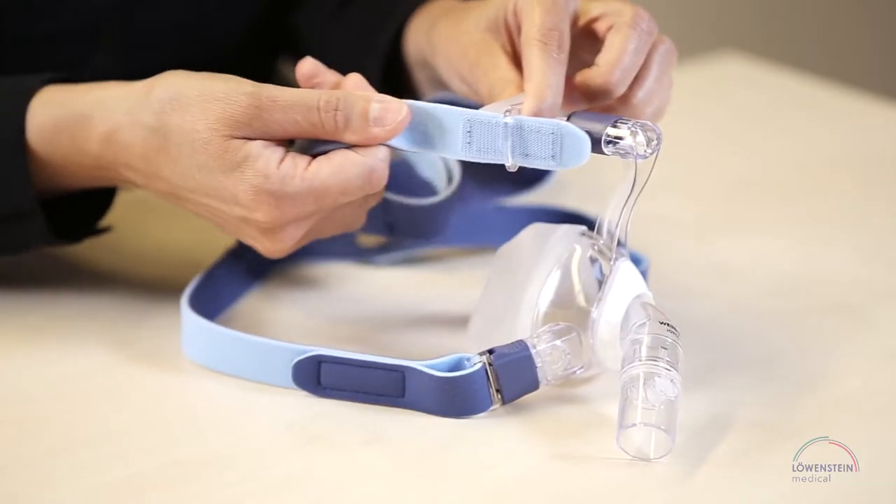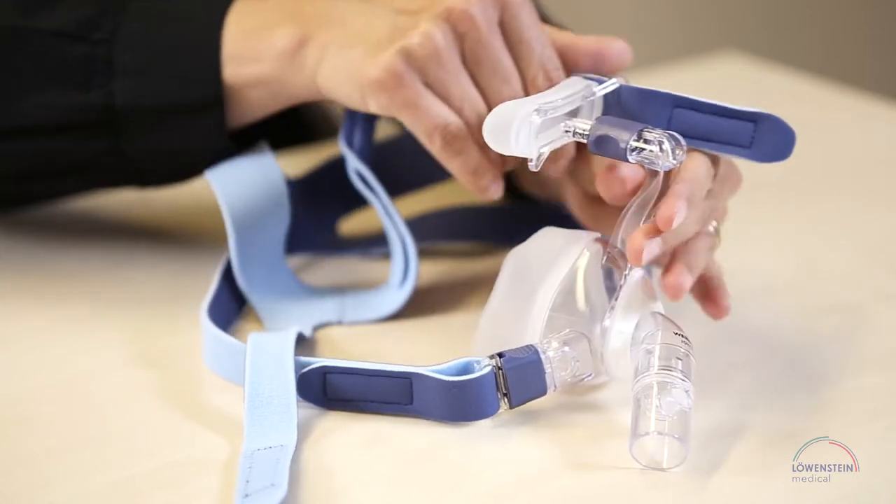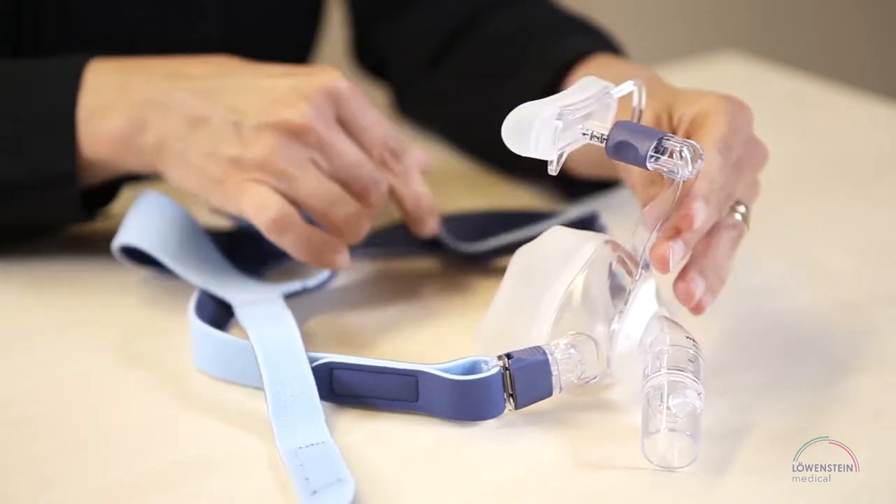To adjust the height of the forehead support, remove the straps from the forehead support. To do so, loosen the upper hook and loop fasteners on both sides and pull the straps out.